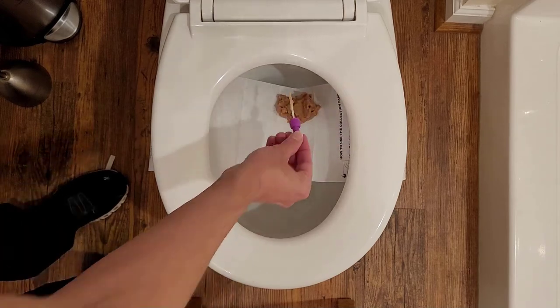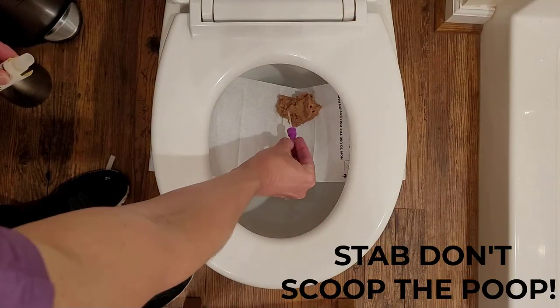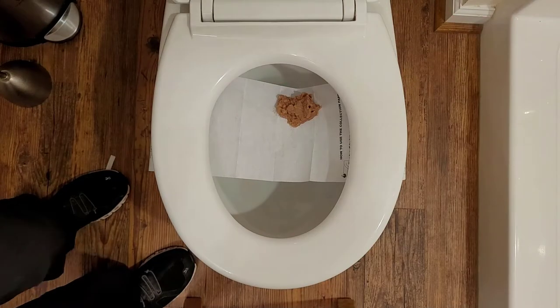You're supposed to poke it six times. It's really important to stab — do not scoop. The most common reason to invalidate the test is if there's too much poop in the vial.